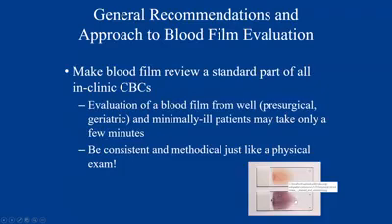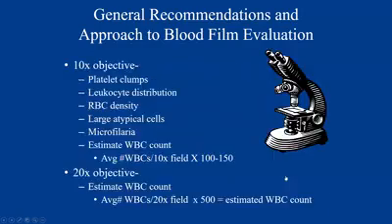If you're onto your feathered edge, then you can get some disruption, and if you go into the body, everything just kind of clumps. Certainly, there are still diagnostically relevant things to find at the feathered edge and body, but morphologic identification occurs in the monolayer of the slide.